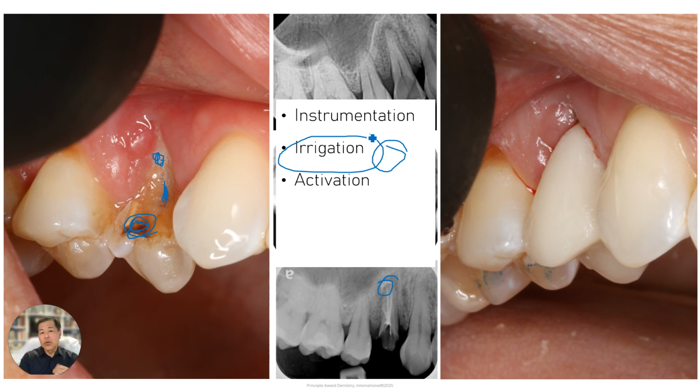In this case, I used the Chlor Xtra, which is the sodium hypochlorite, 6% with the surface modifiers, so it works faster, it dissolves the tissue faster. Then I use the EDTA to remove the dental mud from the canal walls, and then I go back in with my Chlor Xtra, my 6% sodium hypochlorite advanced irrigant to clean out the tubules that are opened up when I remove that dental mud. I'm using activation for both of these to make sure that we get everything out.